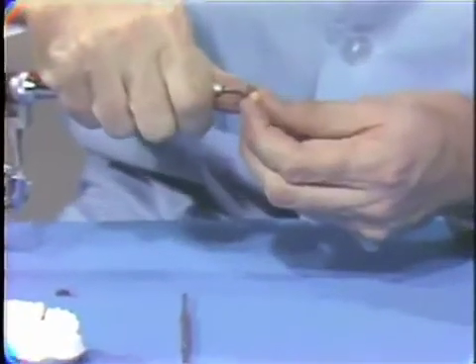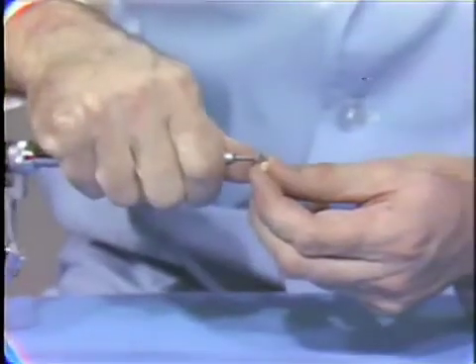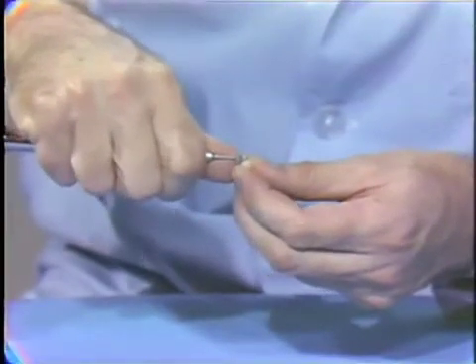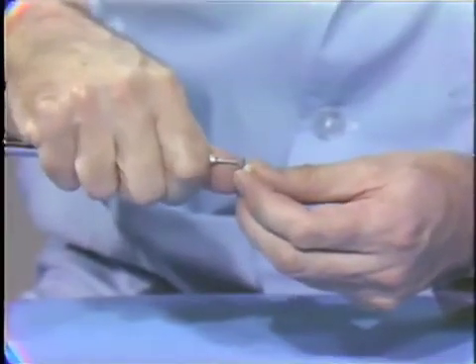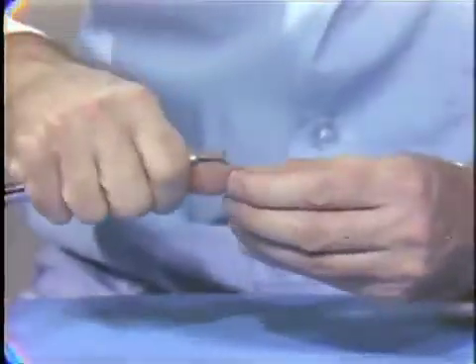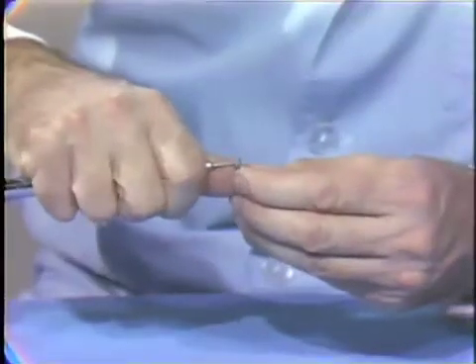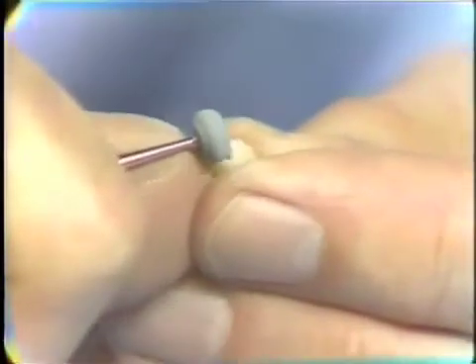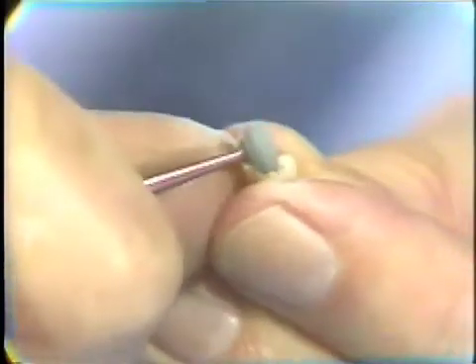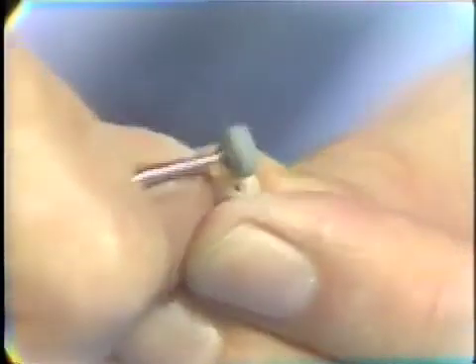So that means a bevel along the proximal here in the region of the contact, which is carried around the lingual and covers over the entrance to the keyway on the lingual surface here.